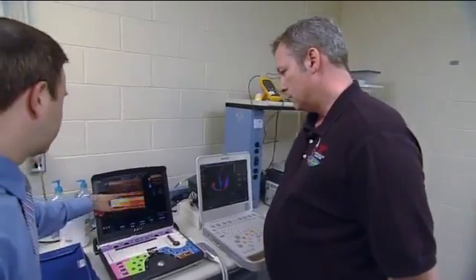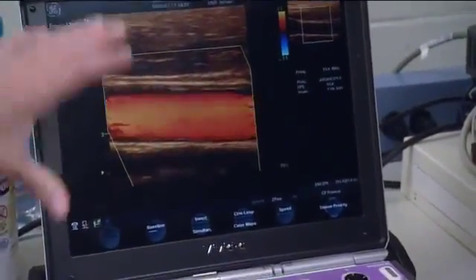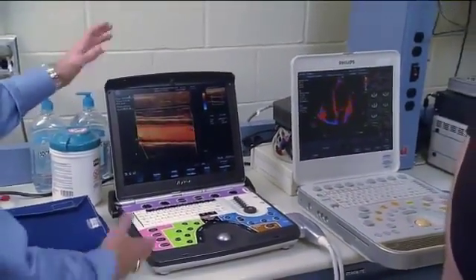So you can actually see the walls here, right? I mean, you can see them expanding and contracting. Yep, so that's the pulsatility you'll see in an artery. So let's talk about portability. I mean, this is no bigger than a laptop, right? Right. Now, let's take a look over here to the right. This is what they used to have on board the International Space Station, something this size. It was about the size of an entire rack. It was a full rack, yes.